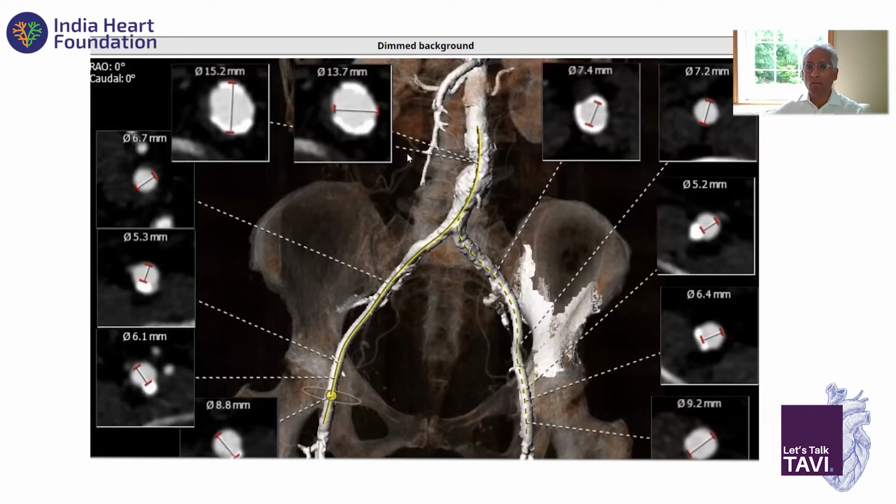Usually for the peripheral artery, you want it to be no more than 1 or 1.5 millimeters. You can occasionally see people do 3 millimeter, 4 millimeter, 5 millimeter cuts. That's fine if the artery looks completely normal, but you can very easily miss significant focal stenosis if the cuts are too large.